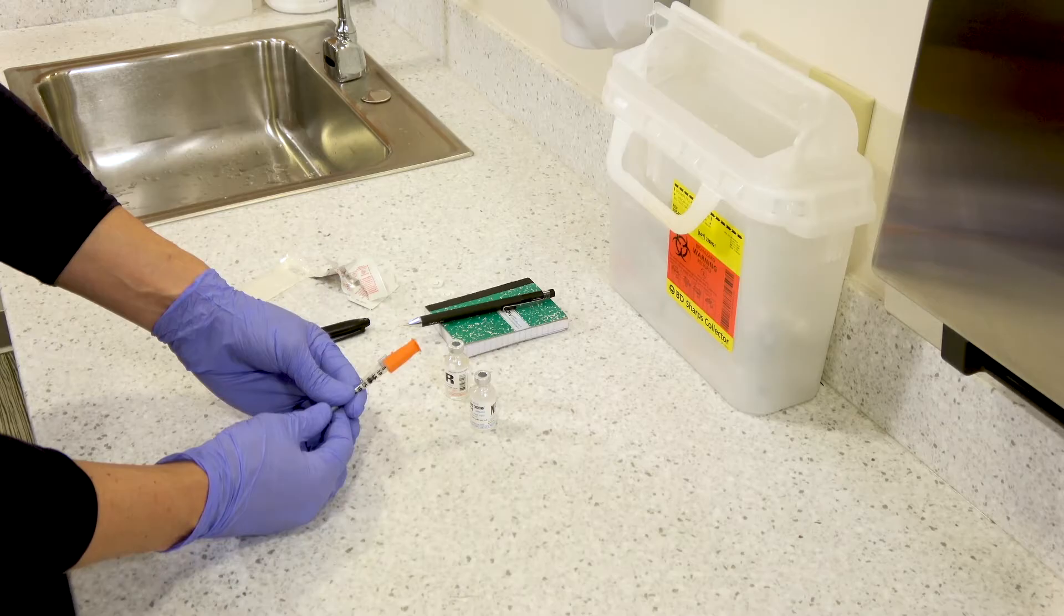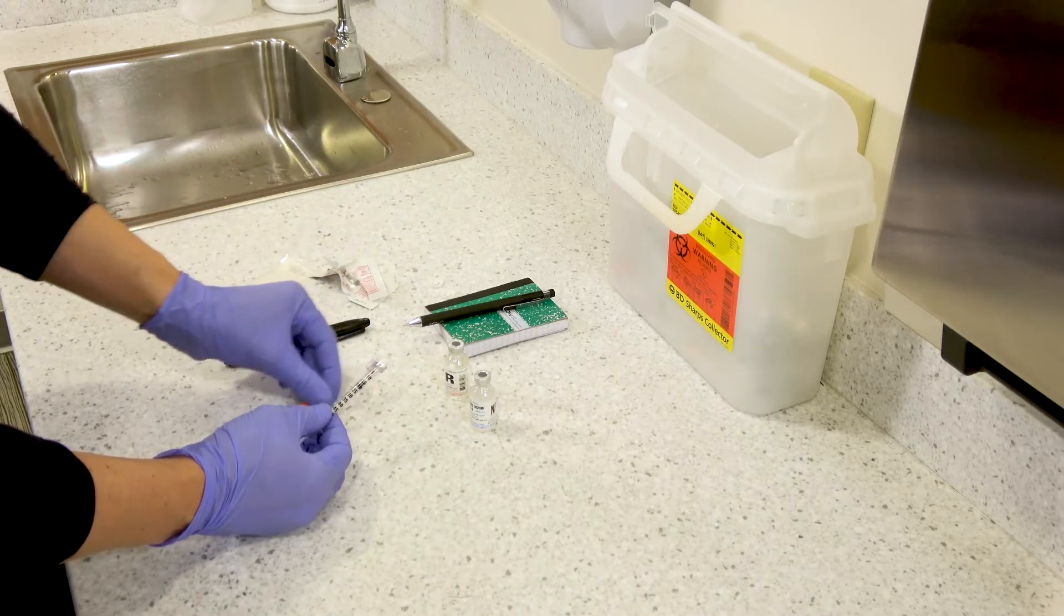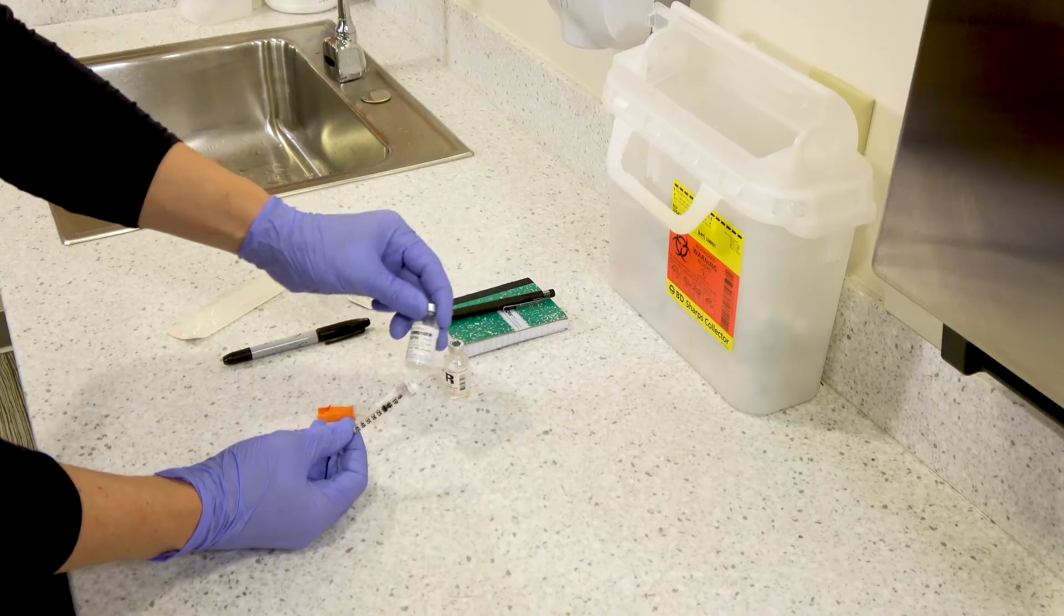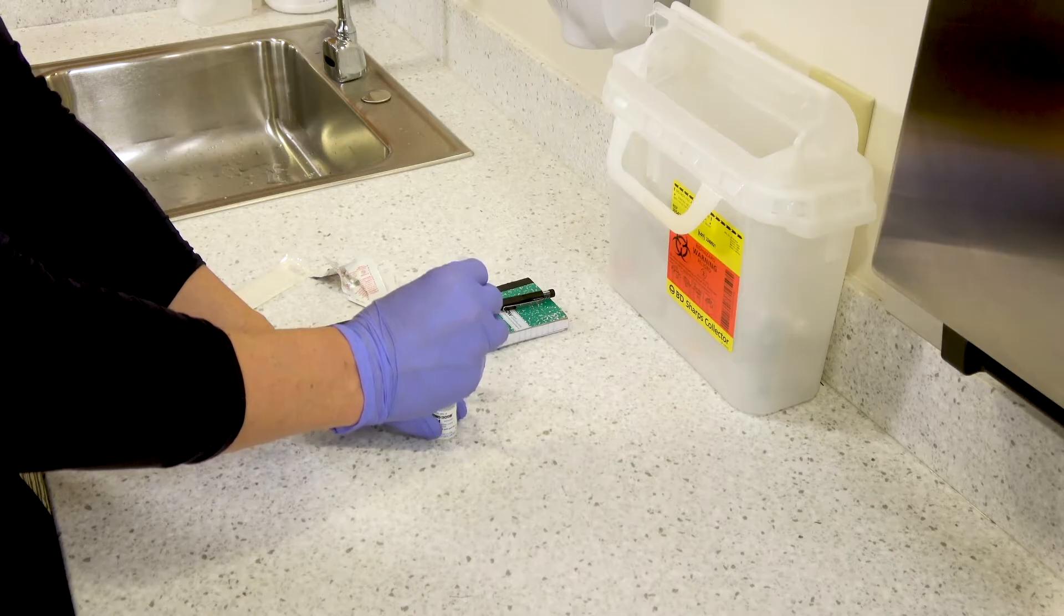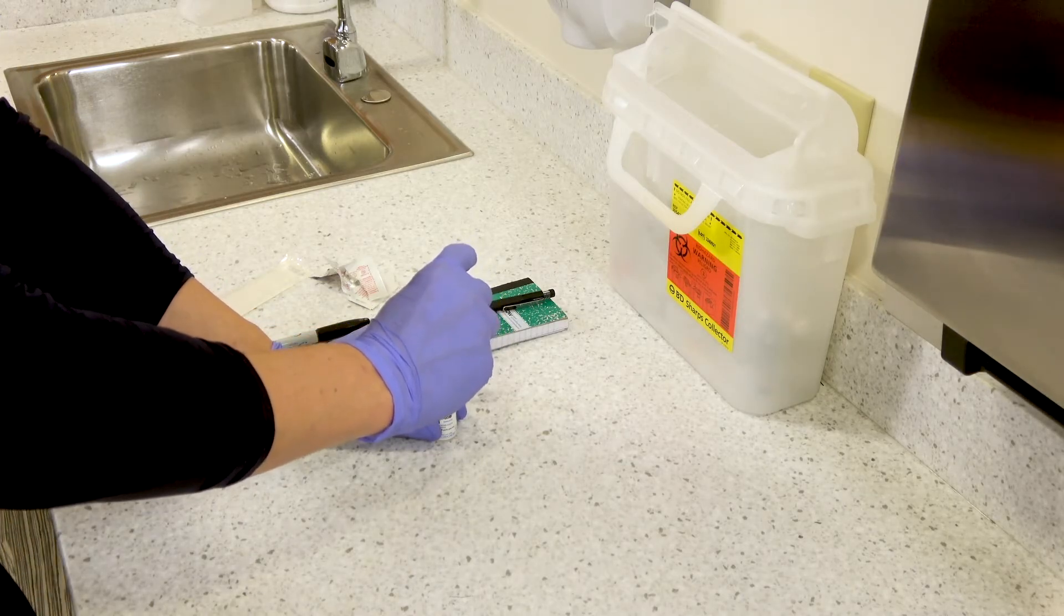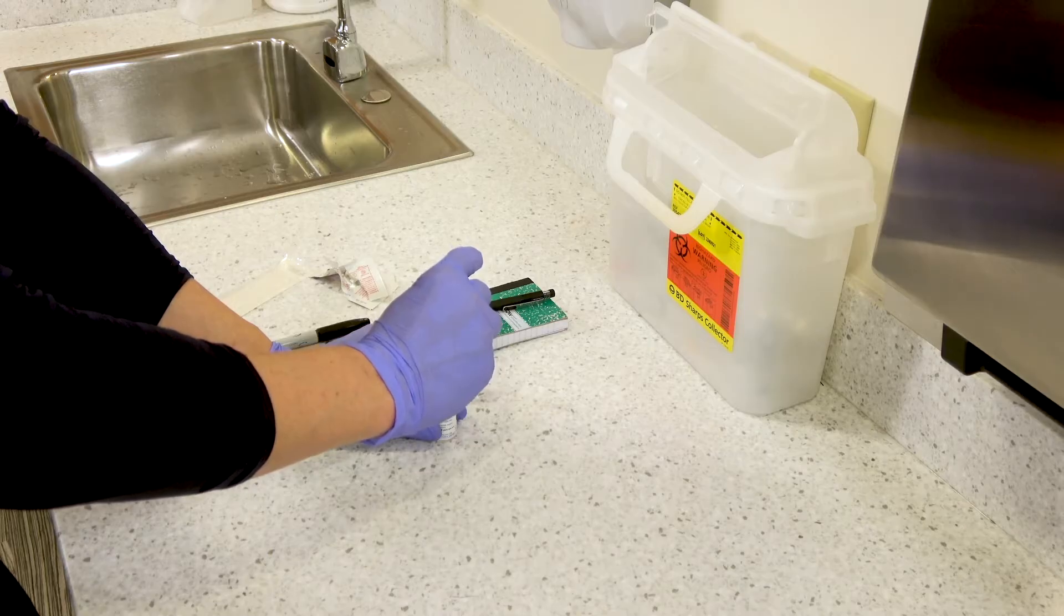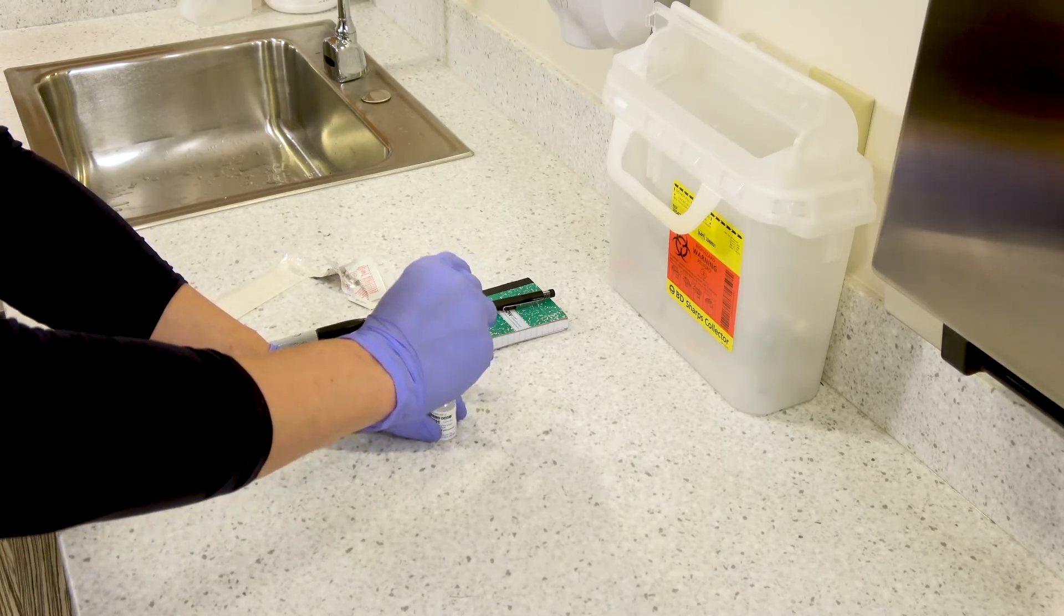Now insert the needle into the NPH vial and inject the dose of air for NPH into the vial. In this case 10 units. So inject the 10 units of air into the NPH vial and then you'll still have 5 units of air in the needle and you can remove the NPH vial.